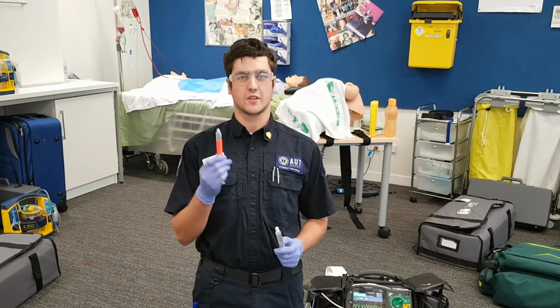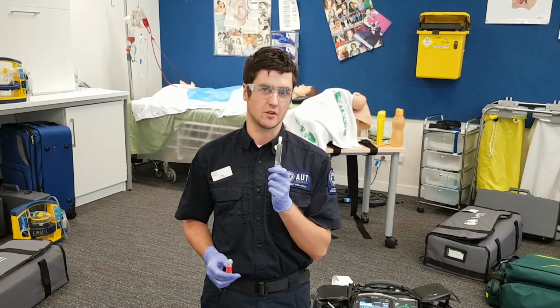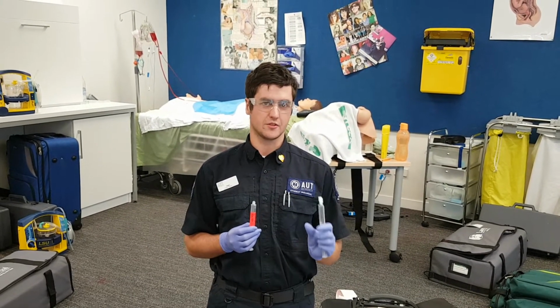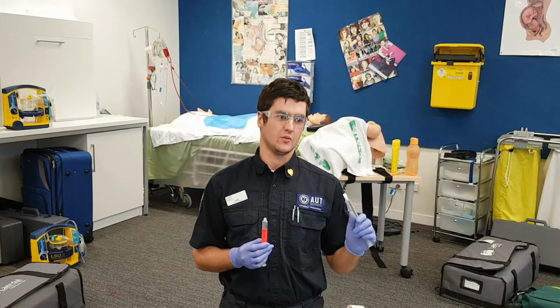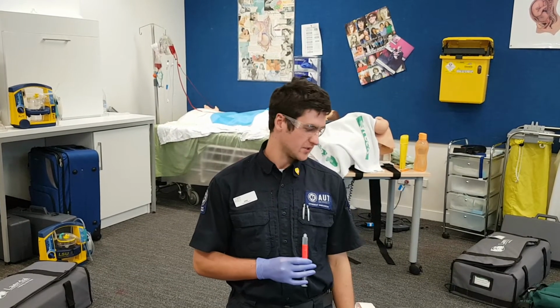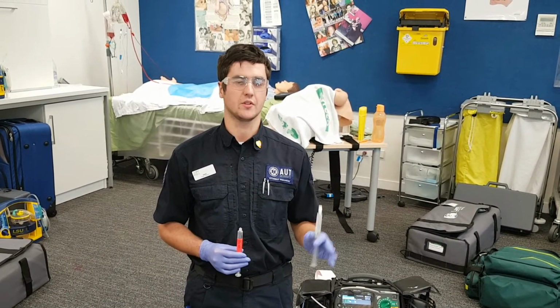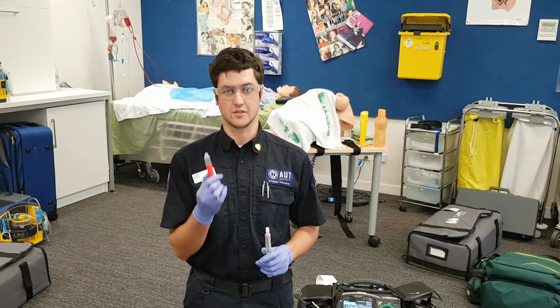For the ketamine, I got my off-sider drug check for it, and also drug checked my sodium chloride. I've drawn up ketamine, I have 100 milligrams, and also drawn up 9 ml of sodium chloride to make 10 mls, which means I have 10 milligrams per ml of ketamine. For my patient, because he is 70 kgs, I want to give 35 milligrams of ketamine, that is 3.5 mls of drug in the syringe.